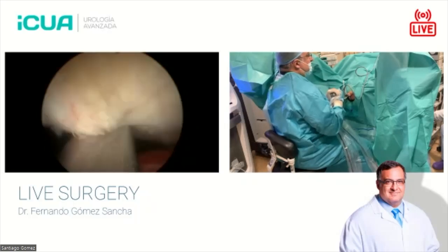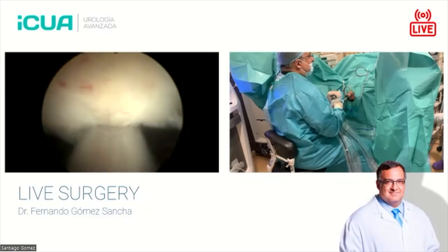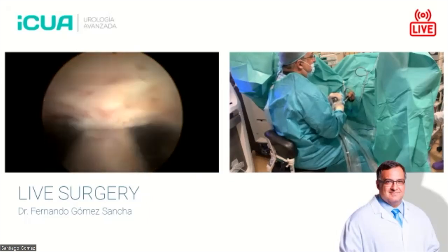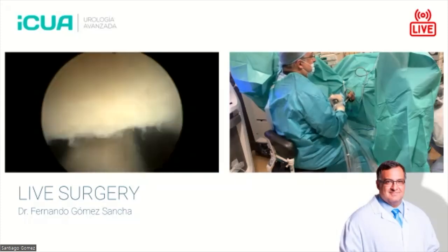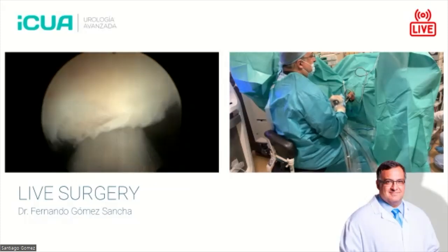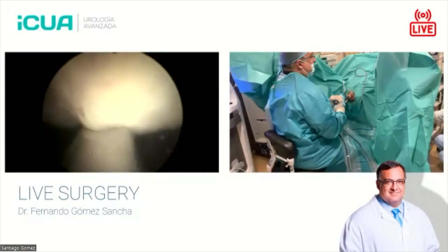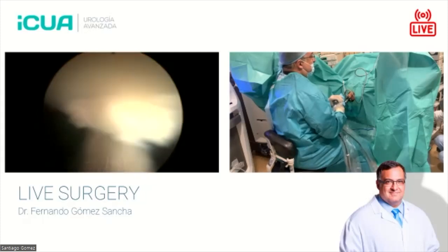With morcellation, my advice is to get the best morcellator you can, because if you have a slow morcellator, typically the morcellation process does not irrigate very well. You are putting water in the bladder, you're sucking water out of the bladder, but it doesn't clean the view the same way as a continuous irrigation endoscope, because there's not so much water coming out, not so much water coming in.